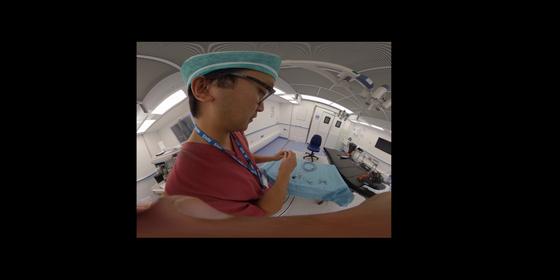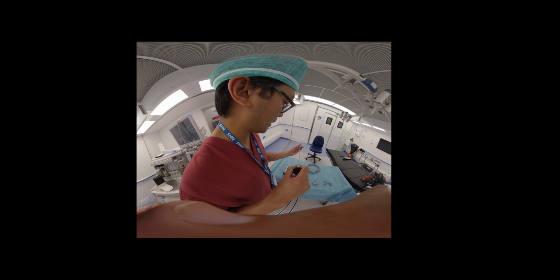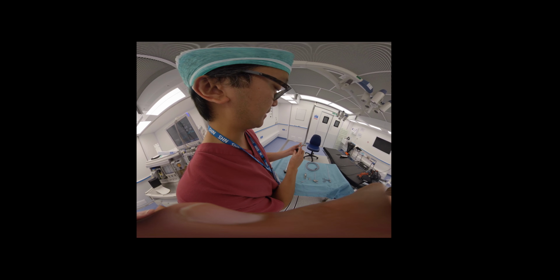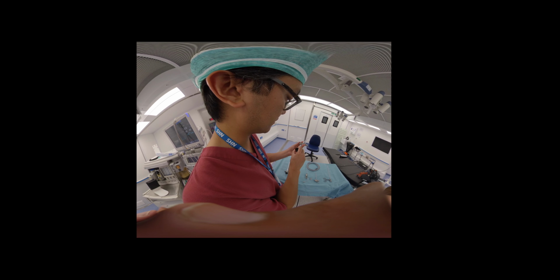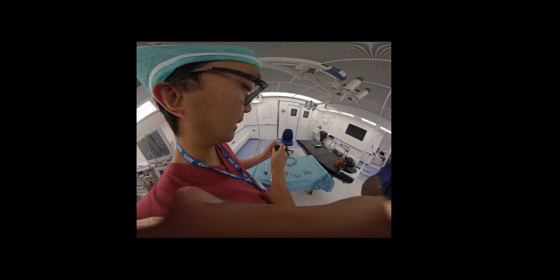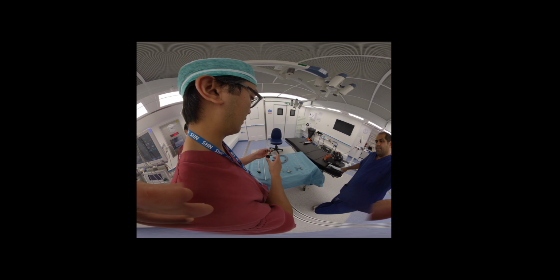Okay, so now your bridge is on. Again, the tab facing upwards near to you so that the lock is open. You can now put your 0-degree endoscope in through there. Okay, and you'd have to try and line up the notches. But remember that your light source should be facing to the right, as per on the bronchoscope and also on the endoscope. So put that in, and then just rotate this lock clockwise, and it will click into place, and you'll be able to feel that. Okay, so now the whole assembly is essentially secure and locked into place, and this is when you can now insert the bronchoscope.